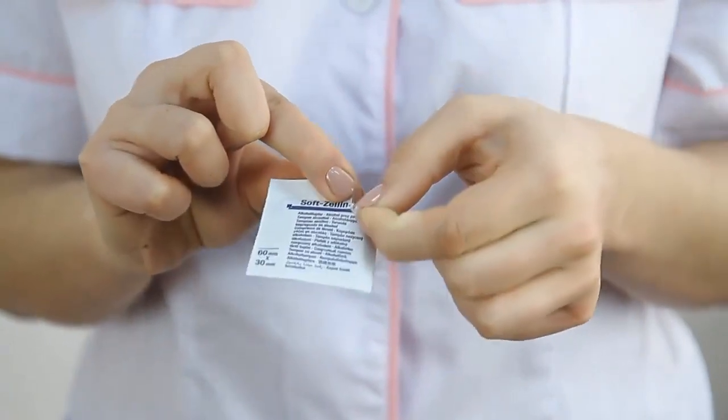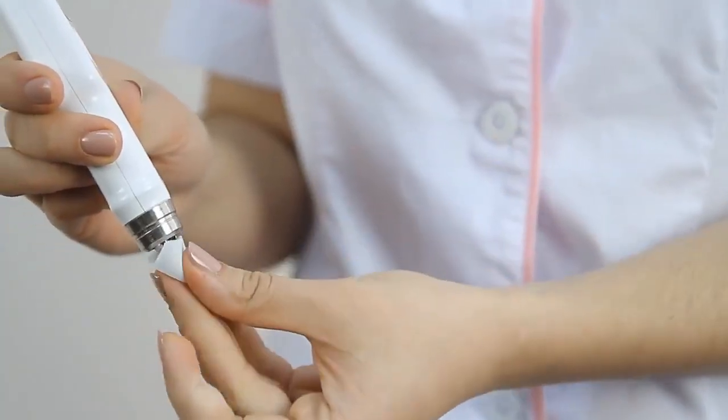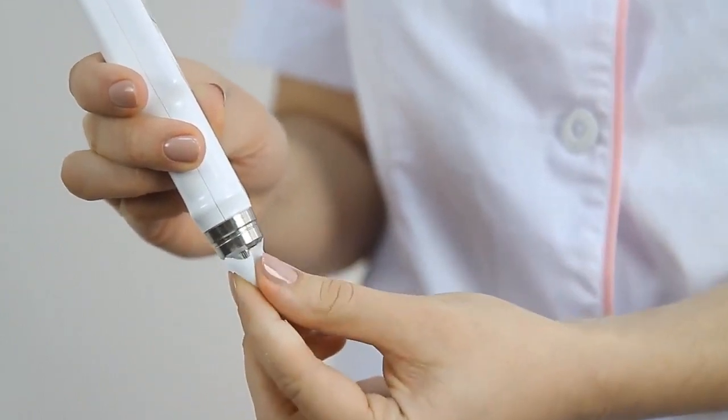First of all, take the protective cap off. Please make sure to disinfect the protective ring and vibrator rod before the first use of the tonometer and before each new patient. Please avoid penetration of disinfectant inside the device.